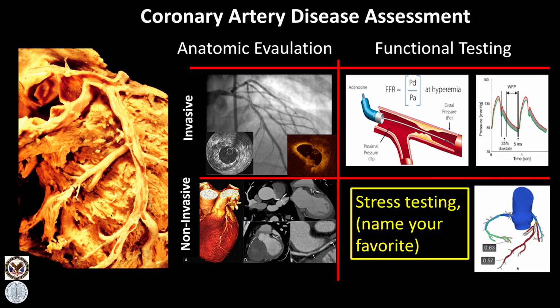On the far upper right panel, we see a diagram of the coronary artery and 2 tracings, the proximal and distal pressure tracings, with a wave-free period, the WFP. This is a particular interval during rest where the resting flow in diastole is high and the resistance is fixed and thought to be low.